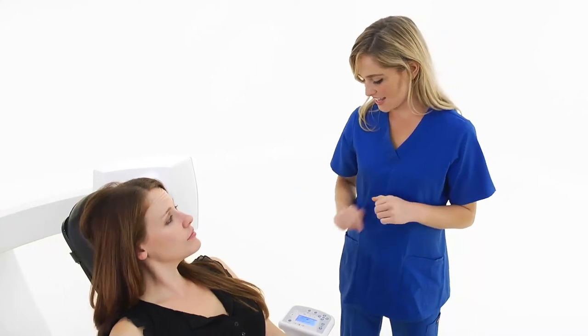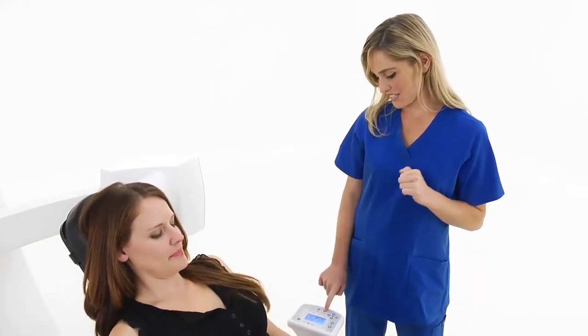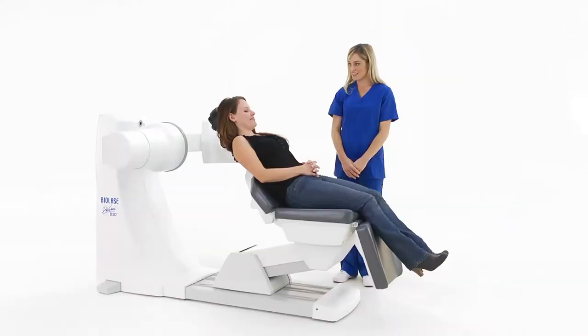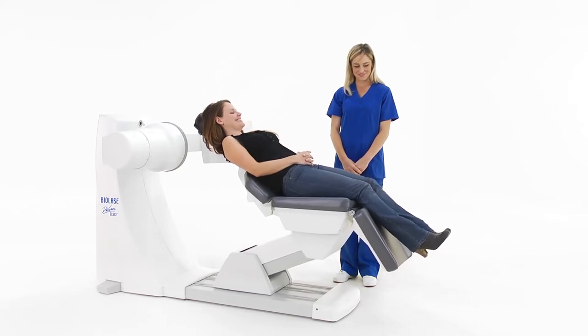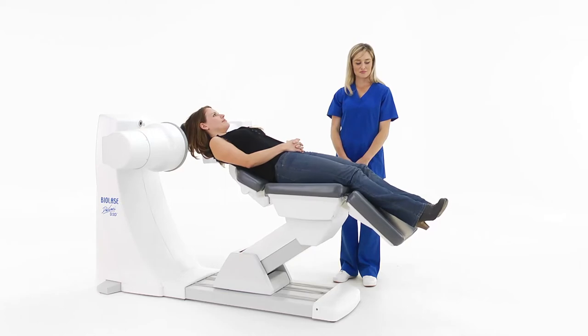The D3D offers a comfortable reclining seat for optimal image stability, without straps, bites, or other physical restraints. The reclined position reduces the chance of patient movement blurring the image, and the ergonomic seat makes the patient comfortable.